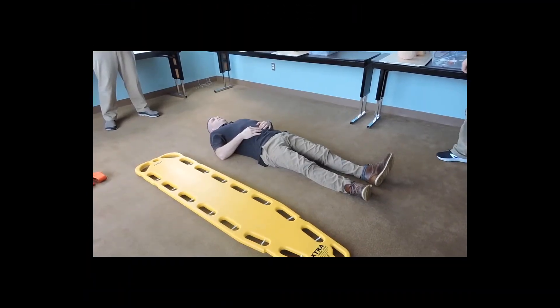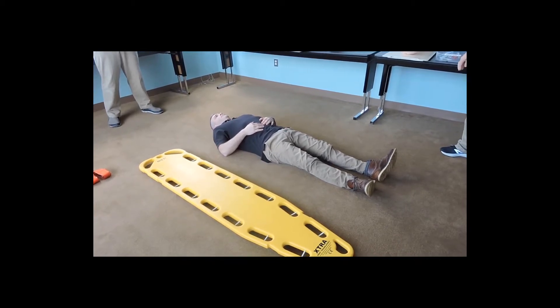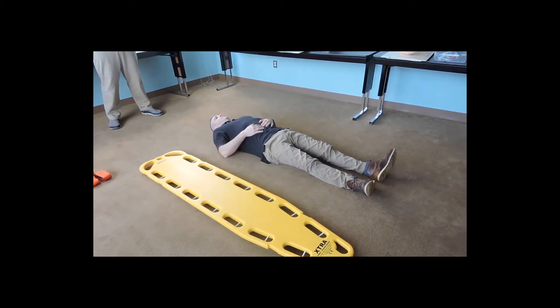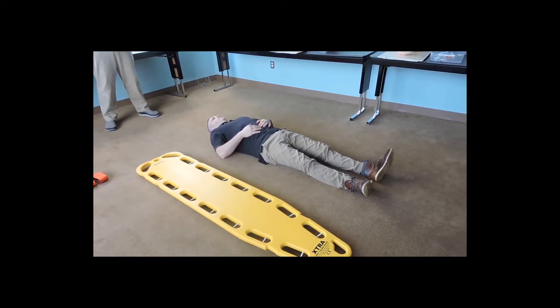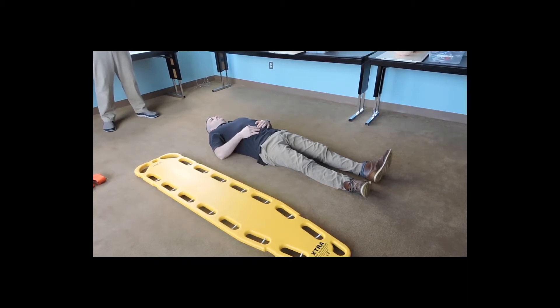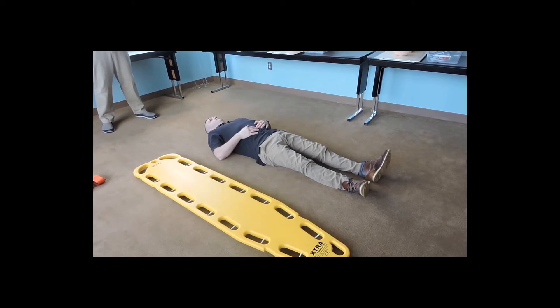Your objective in the station is to mobilize properly and prepare a patient with a possible spinal injury for transport. You have chosen the supine card. Your patient is conscious and alert with a suspected cervical spine injury. Your partner will work under your direction. Please be sure your partner understands and performs according to your instructions. You'll be evaluated on your individual performance and the direction you give to your partner. You have 15 minutes to complete the skill. You may utilize whatever equipment is available in the station.